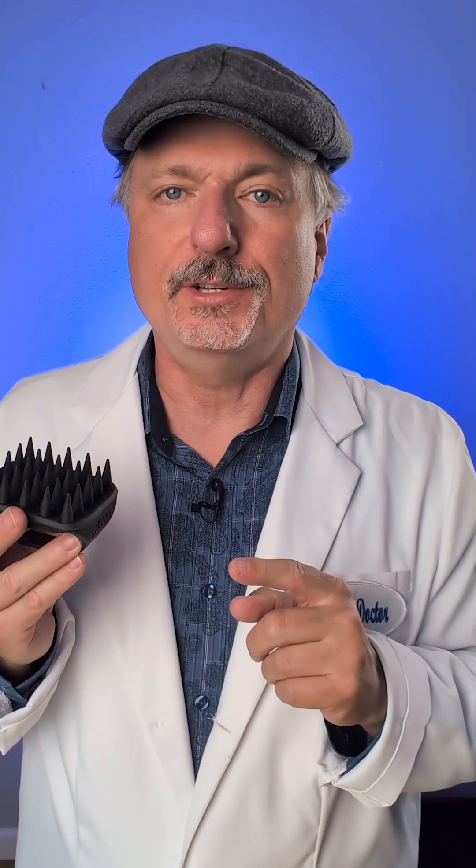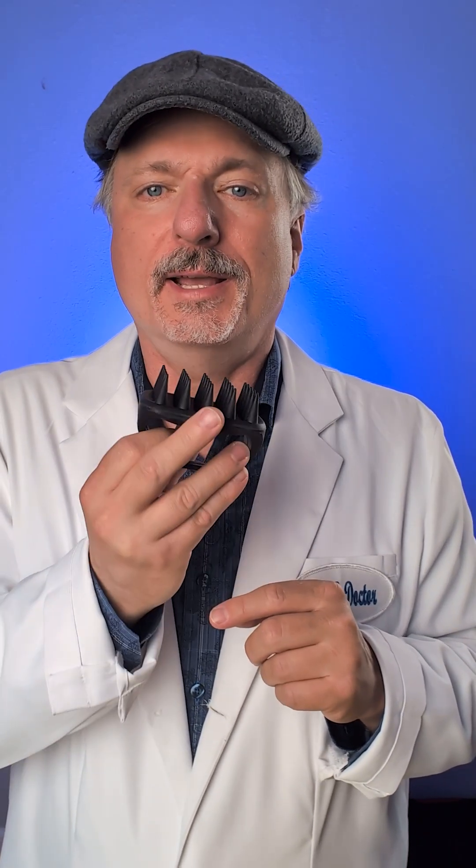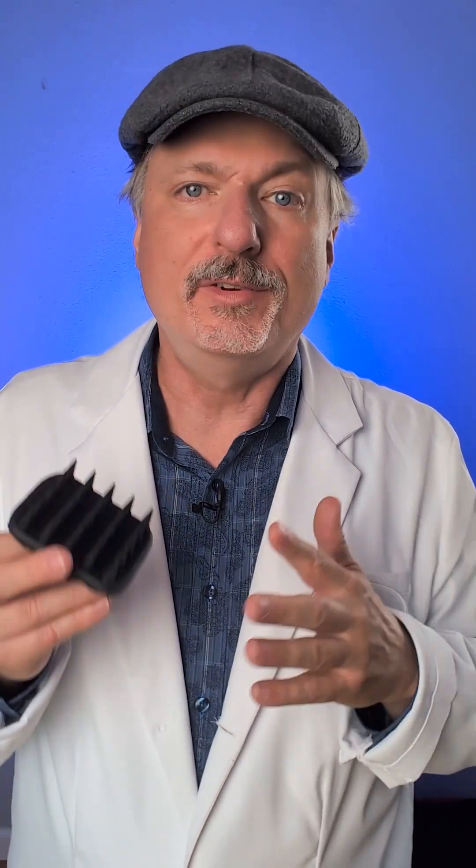Even stubble can compromise the seal of your respirator by making a gap in between the sealing surfaces. Now you can try to compress that down, but there will still be gaps that gases and particles can get through. Don't be mistaken — you can get some protection even with a beard, and some protection is sometimes better than none, but it's not the protection you're paying for when you get a respirator.